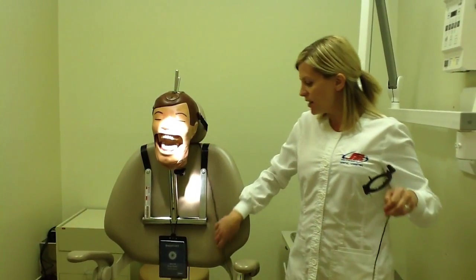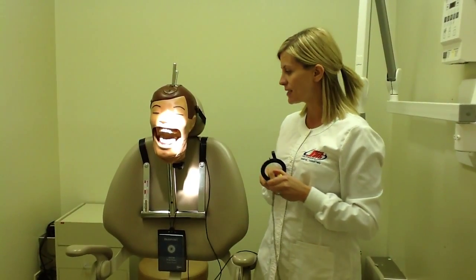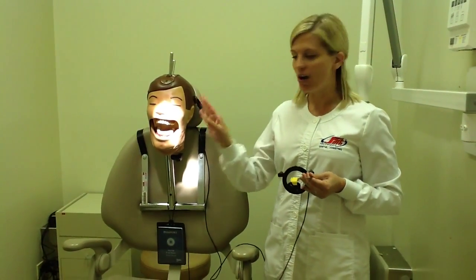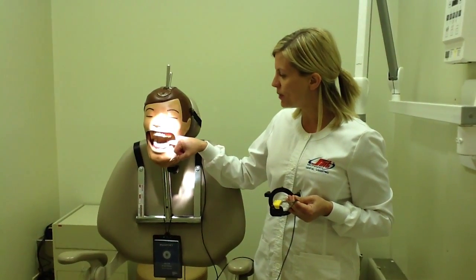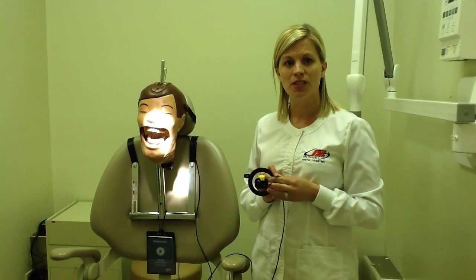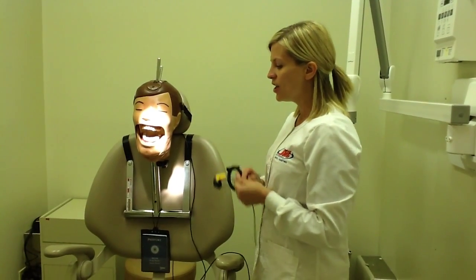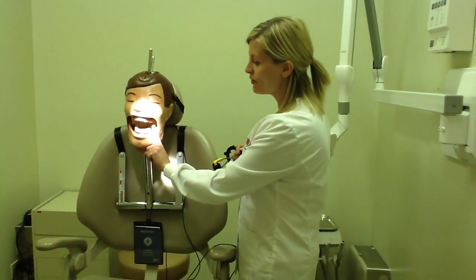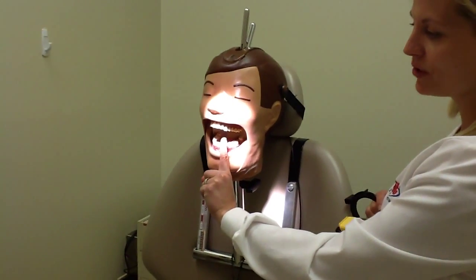Okay, so now that that's done, we're going to demonstrate taking a periapical of the patient's 3/6. First of all, we want to identify the long axis of this tooth. We want to see the occlusal surface of the tooth and identify where you think the root, the apices and the root tip lines, is. So you have to visualize that. You want your receptor to be parallel to your long axis. So if your tooth is in this position, you want your receptor to be parallel to it.